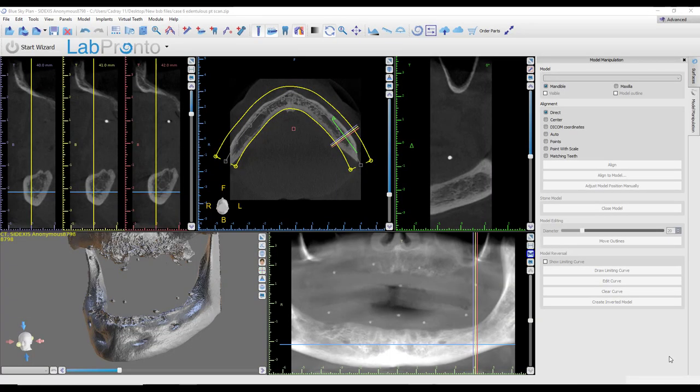Hey, this is Dr. Corey Glenn with Blue Sky Bio, and I'm going to show in this video how to map the mandibular canal and also how to evaluate for an anterior loop in Blue Sky Plan.